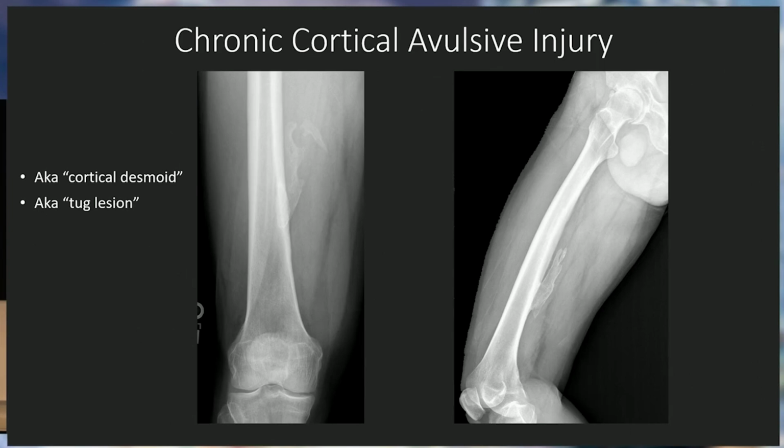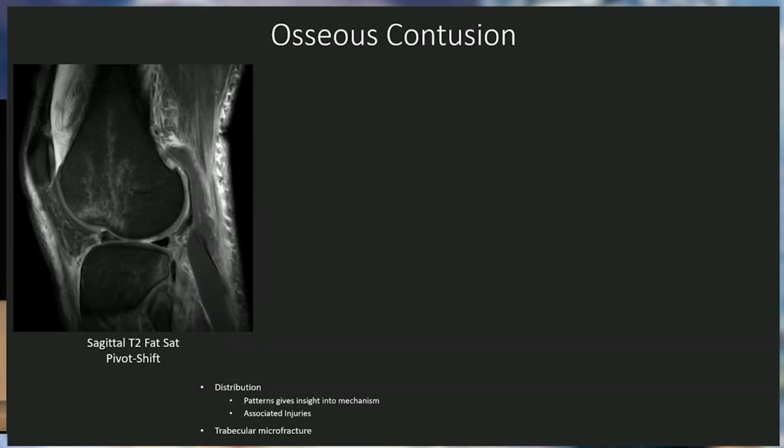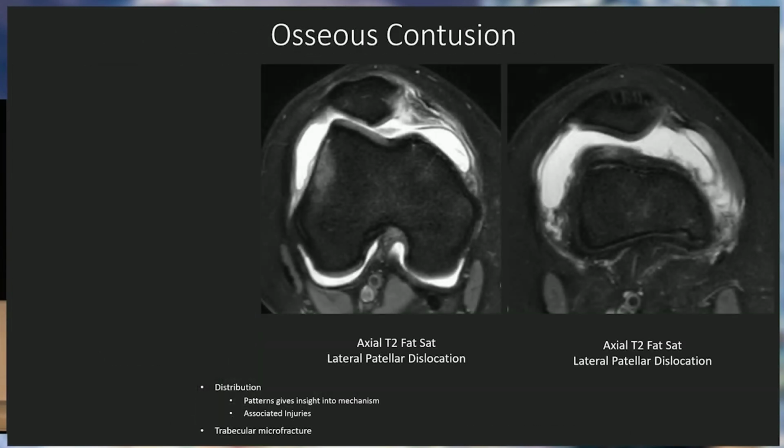It's fascinating. You outlined some different types of trauma and how things might appear, and that might be an interesting way to go forward. You talked about tibia stress reactions, and you had some slides on foot stress fracture. And another example you gave was a pivot shift ACL tear and a lateral patella dislocation. What would you expect to find as far as T1, T2, and how would the image appear to you if you were looking at those types of injuries?